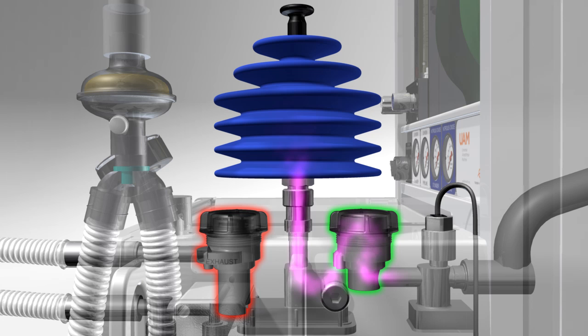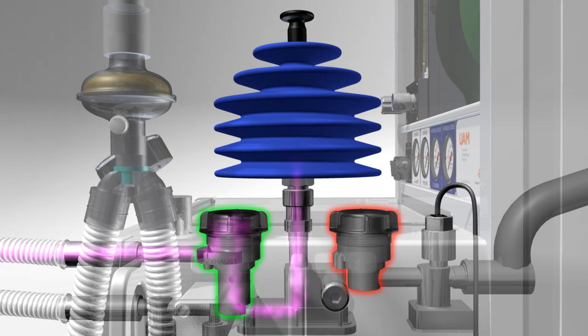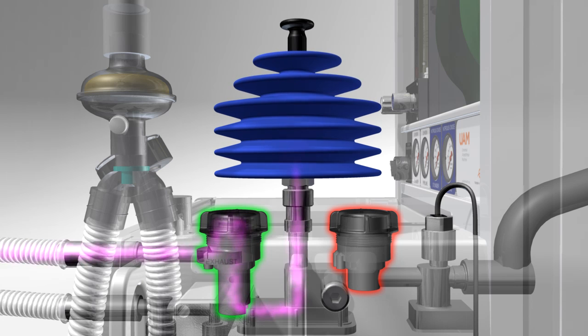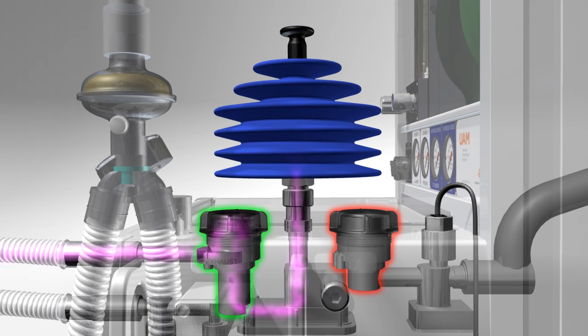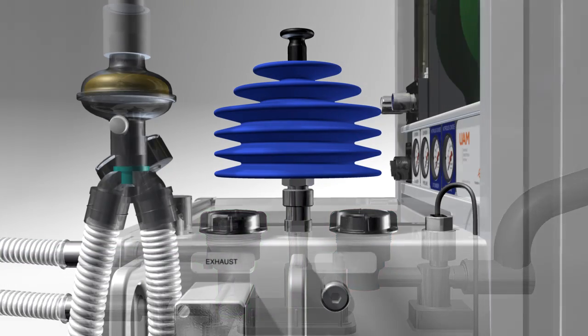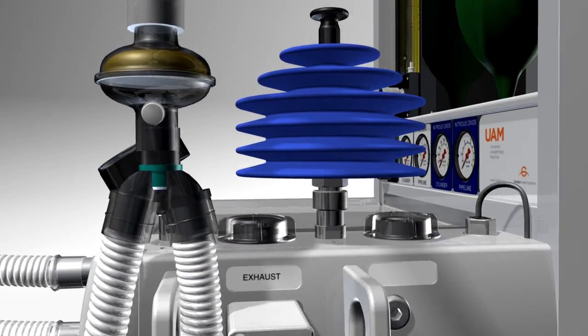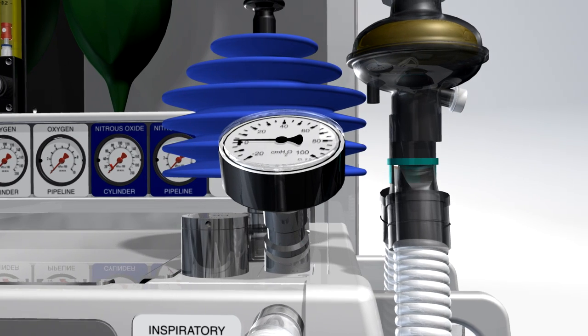As the bellows are pushed down, the gas flows out through the second non-return valve into the inspiratory limb. The first non-return valve is closed. Another pressure relief valve ensures that excessive manual force on the bellows cannot cause harm to the patient.